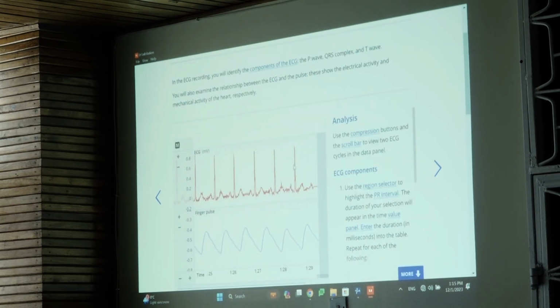Sometimes you really get a bit of background noise. One thing also to mention: in this education software, all the filters are set. It's basically done to work ideally. In the research part, you can really change the filters.